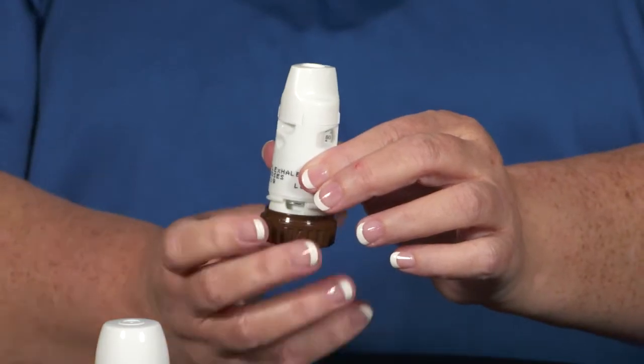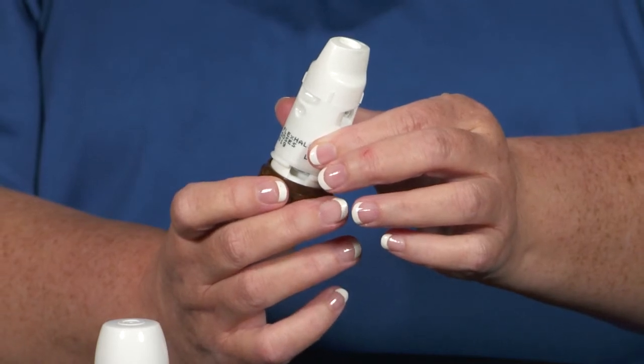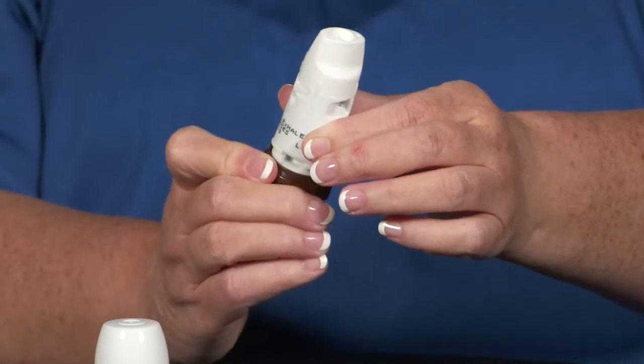Hold the inhaler in the middle of the white part with one hand and load the medication by using the other hand to turn the bottom end of the inhaler all the way in one direction and then all the way in the other direction, making sure you hear the click, like this. This click means the dose is loaded and ready to be inhaled.